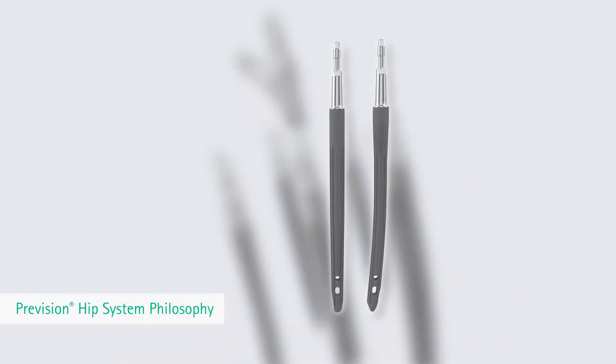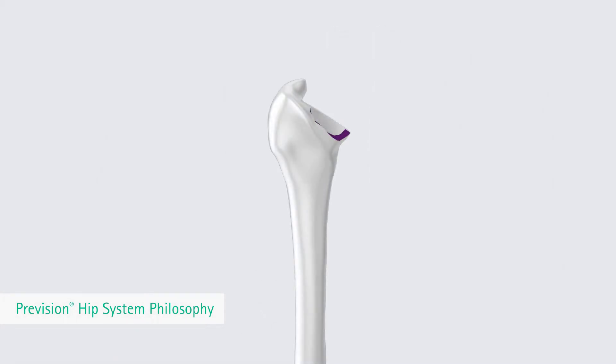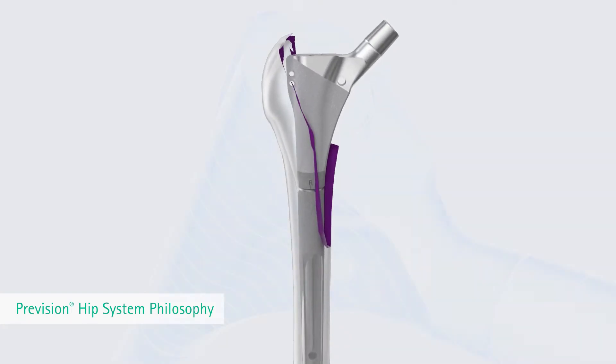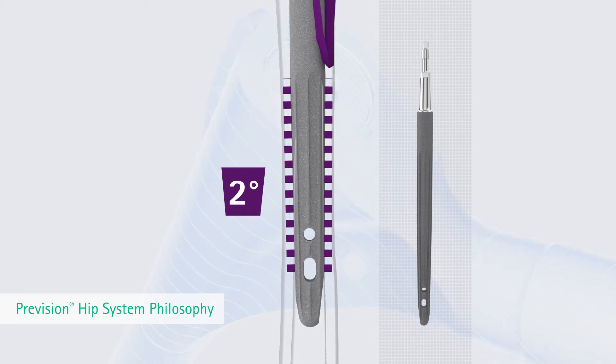This can be realized with straight or curved stems. Since 2004, the philosophy of the Prevision Modular Stem System is to first achieve primary distal anchoring due to press fit. The straight Prevision Modular Stem assists in obtaining a stable distal fixation compared to the curved stem, with a 2 degree larger conical angle.